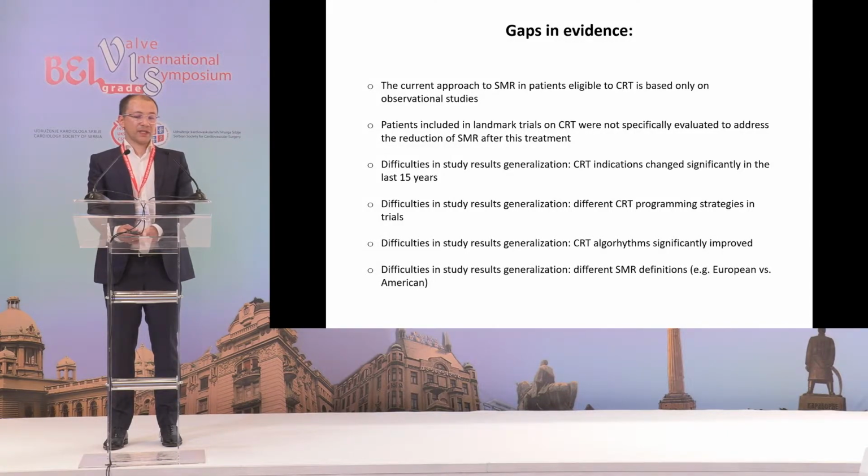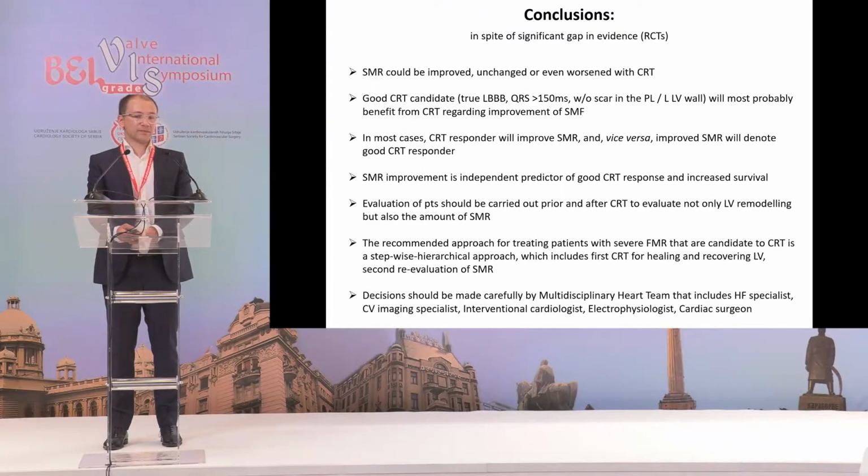Opet, ovo se sad tiče više ehokardiografije, postoje i različite definicije sekundarne mitralne regurgitacije, na primer definicije evropskih i američkih udruženja. Dakle, uprkos značajnom nedostatku u dokazima u vidu randomizovanih kliničkih studija, znamo da CRT može da poboljša, ali i da ne promeni, čak pogorša sekundarnu mitralnu regurgitaciju.